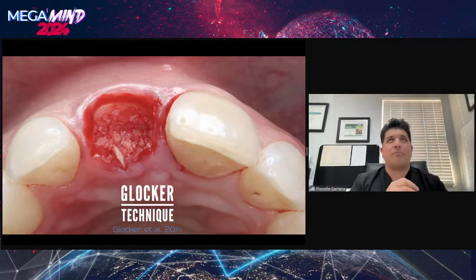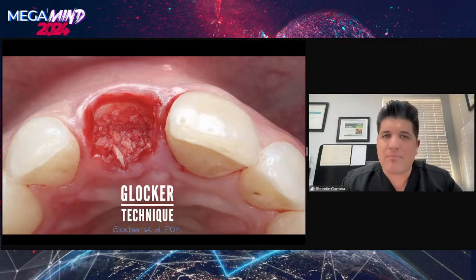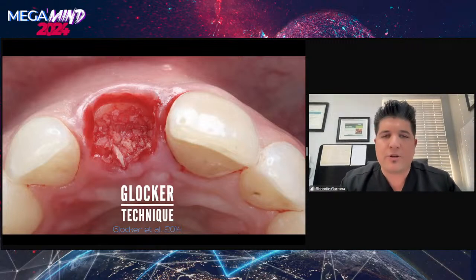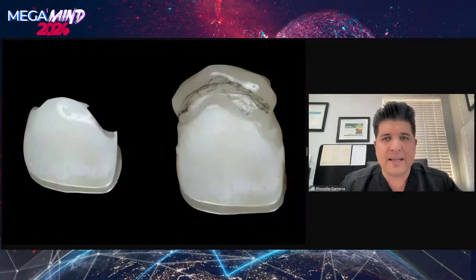And I think that the benefit of this is largely underreported and underrated, because, you know, if you can have a fully healed ridge and come back and place the implant into a healed ridge, and the implant is circumferentially encased in bone, the chances of success are much higher, especially when you don't have a lot of palatal bone to engage that implant into. So I grafted the case and I let it heal up.